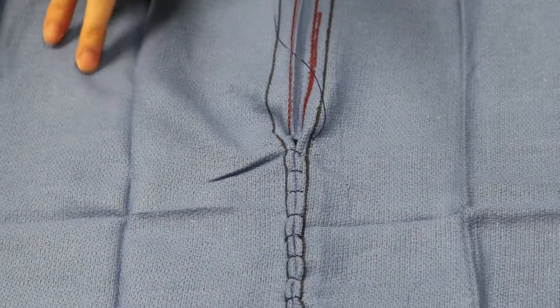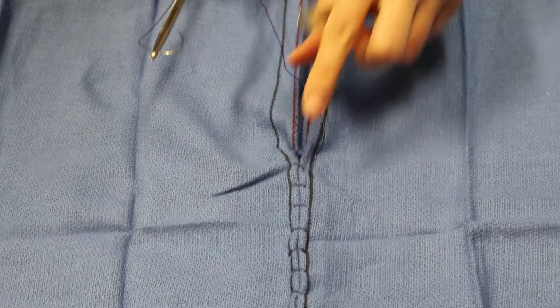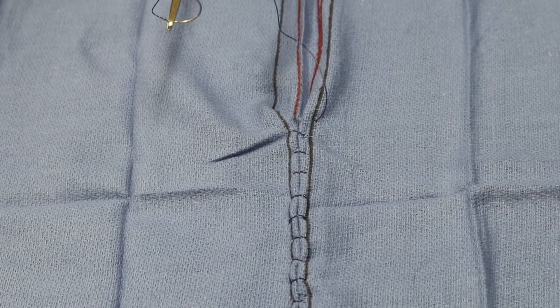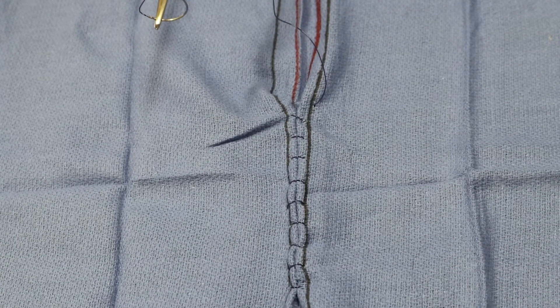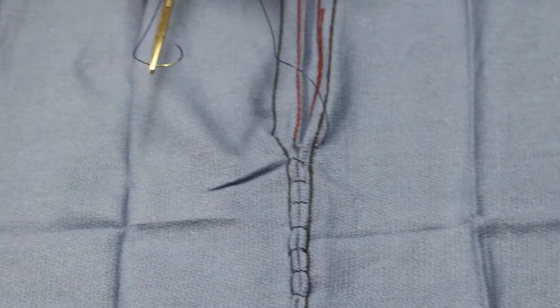We're at the end of the incision now and we've just sewn past the final edge of the incision. So now what we're going to think about is how do we build a deep loop and a deep leg to tie to.